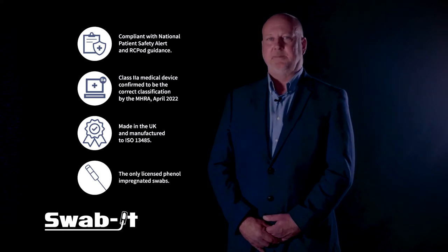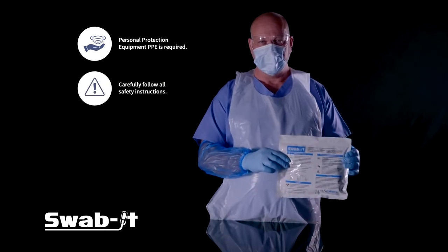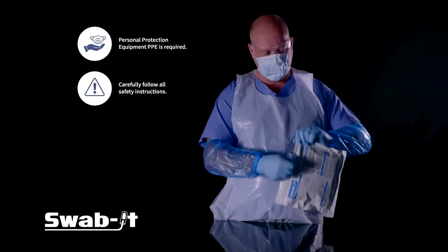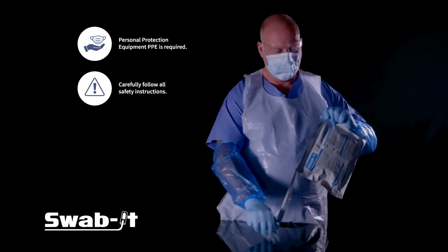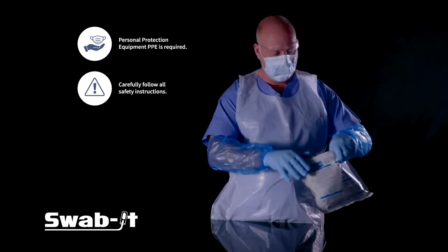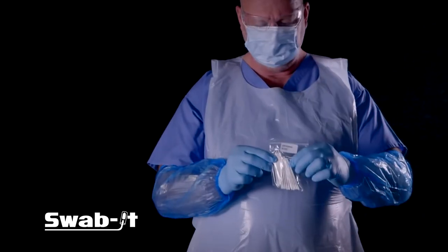Personal protective equipment is required in accordance with the safety instructions clearly printed on the pack. The 30 individually wrapped swabs come in a packet with a tear-off top. Tear off the top and open the zip reseal. This can be resealed after use. Also included in the packaging are swabs of a smaller diameter should they be required for your procedure.